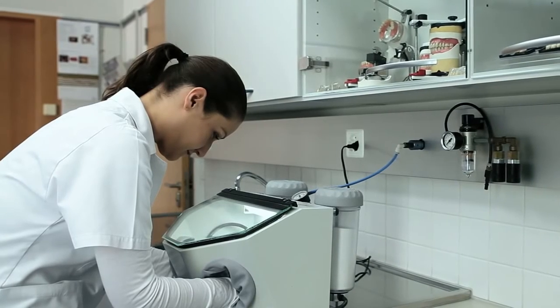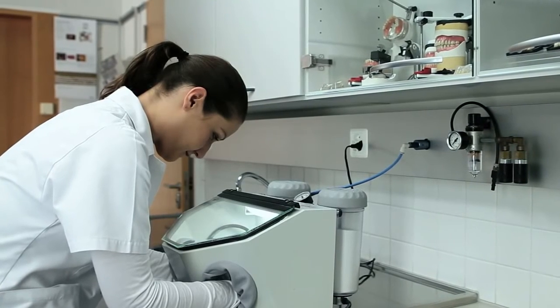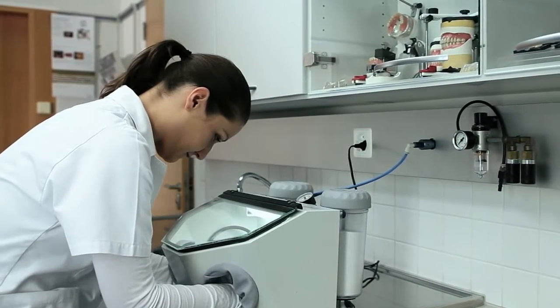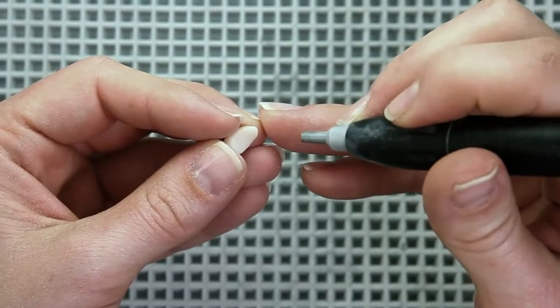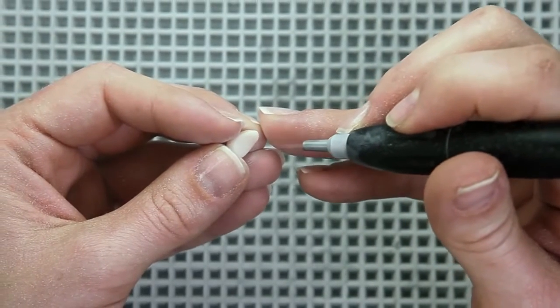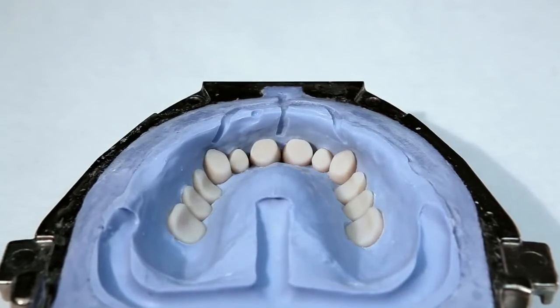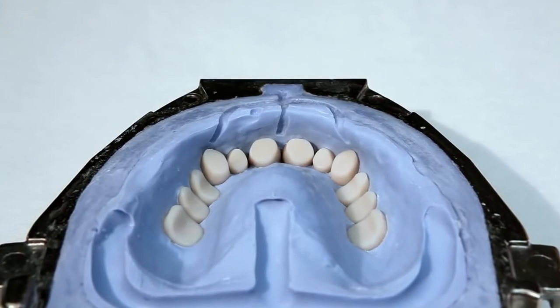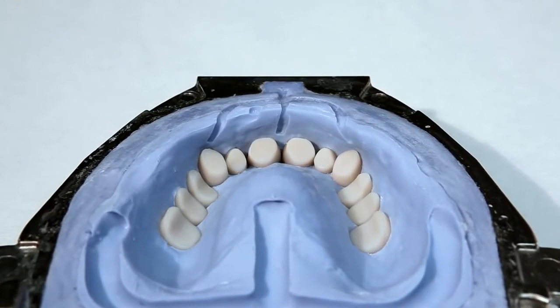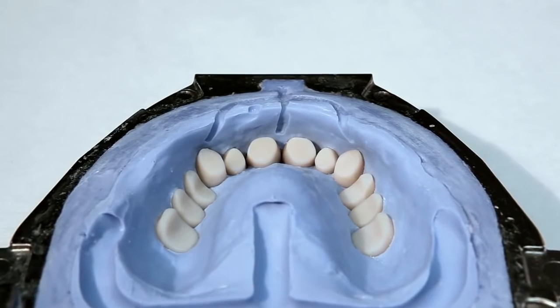After cleaning, roughen the basal surfaces by slightly sandblasting them. As an alternative, you can roughen the surfaces with a cross-cut burr. For further information on the processing of resin teeth, please refer to the instructions of the corresponding tooth manufacturer.